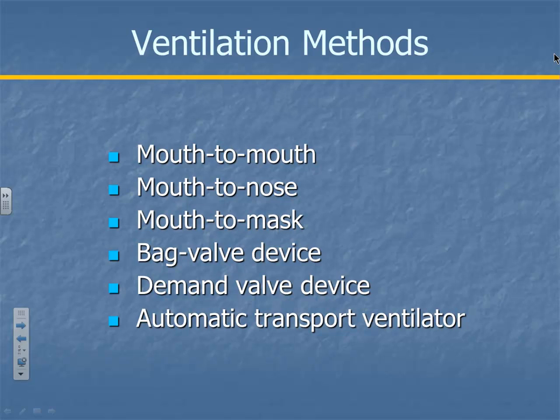But what it does, it's got a forced air ventilator on a pressure valve, and it's run by the pressure of the oxygen. When you push that button, it's going to go psh, like that. It's the flow regulated oxygen powered ventilation device. Did y'all get that? Yeah, me either. And there's not even a good acronym there.